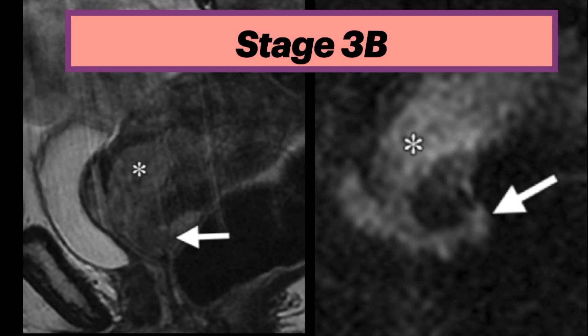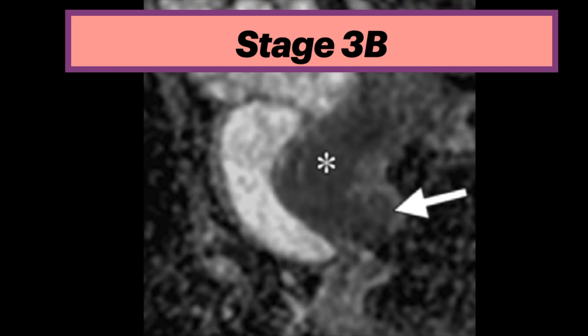This is an example of stage 3b endometrial cancer. The sagittal T2 shows a large isointense endometrial tumor extending into the upper aspect of the vagina, shown by the arrow. The sagittal diffusion-weighted image shows the hyperintense tumor invading the upper vagina, and the corresponding ADC map shows the tumor is hypointense due to restricted diffusion. This patient had renal failure preventing IV contrast use; diffusion-weighted imaging was adequate for disease staging.